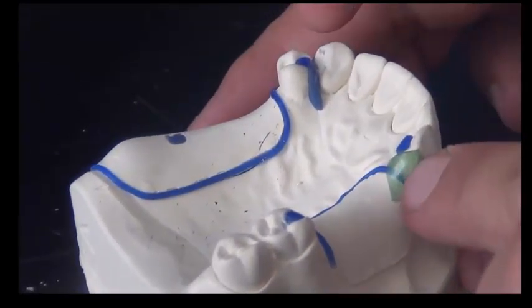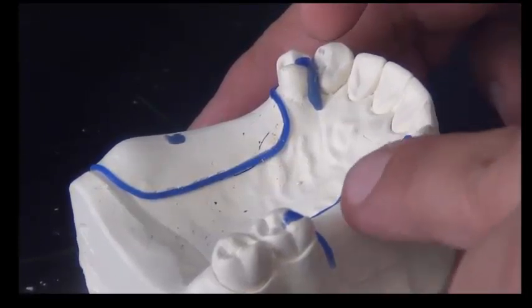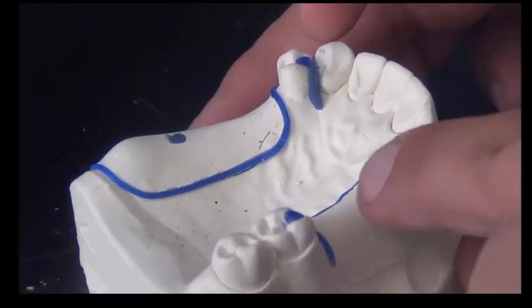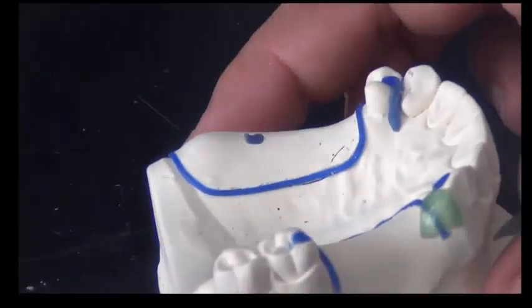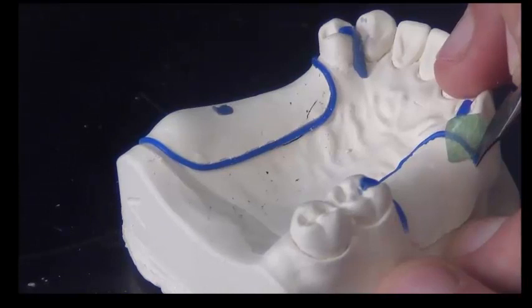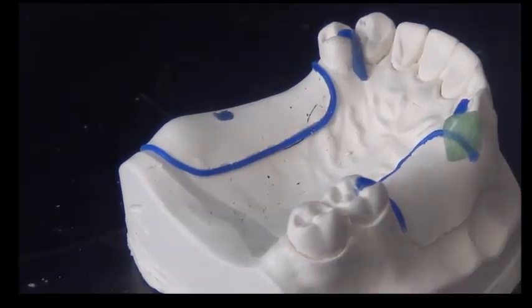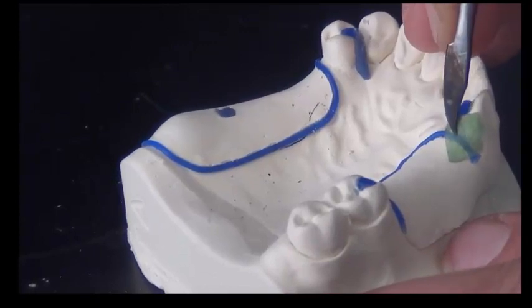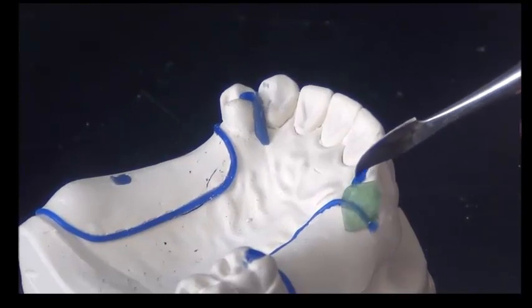So I brought a square piece of wax, and because the canine morphology is almost like a triangle from the proximal surface, I just put the corner of the gauged wax on the tooth. I fit it on the tooth, adapted it, and I'm going to remove any excess. We know that the guide plane preparation runs from palatal to buccal, and we're going to confine the wax added, which will become the guide plate, in the same area where this is added. So we brought a square of gauged relief.